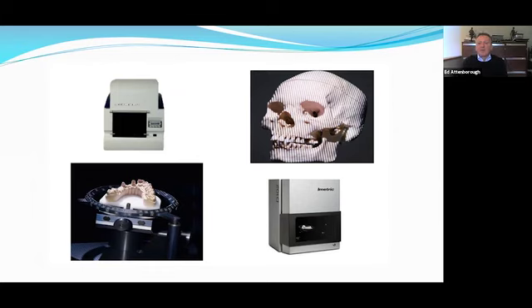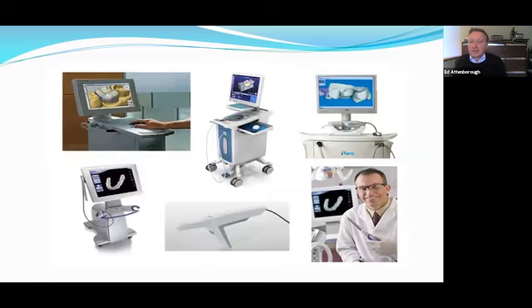So the second file format that is also now an industry standard open file format is called PLY, and the PLY file format is the same as STL in that it represents the surface of the object with a triangle mesh, but then on the triangle mesh it overlays a skin which represents the texture and color of the object that's being scanned. And so now there are 2 file formats, certainly in intraoral scanning, that have become very popular, and they are STL and PLY. So if we can remember those various attributes, let's have a look now at intraoral scanners.